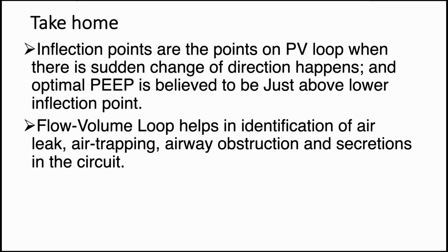Second, studies using CT scans and many physiology studies have shown that in fact the optimal PEEP is well above the lower inflection point. Another thing, and the most important, is that none of the studies have shown that if you try to titrate PEEP, or for that matter any setting, as per the lower inflection point, it makes any better clinical outcomes.